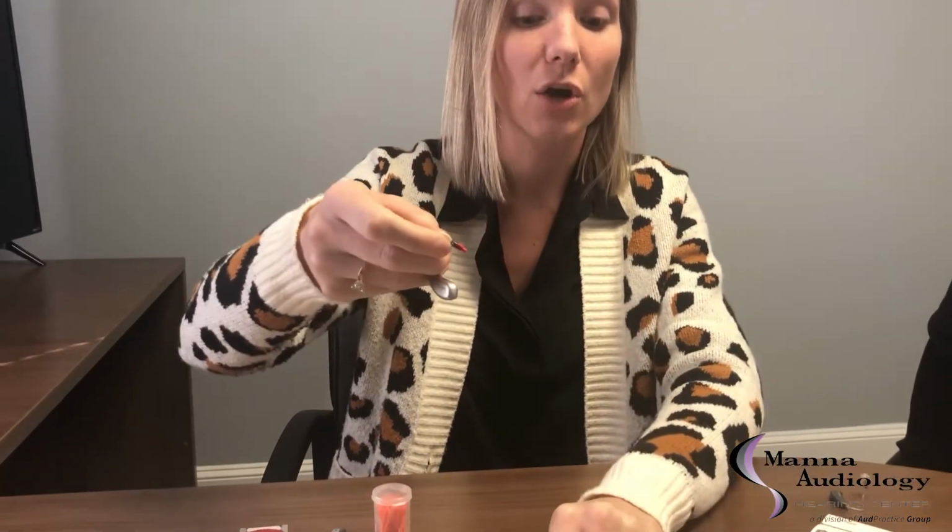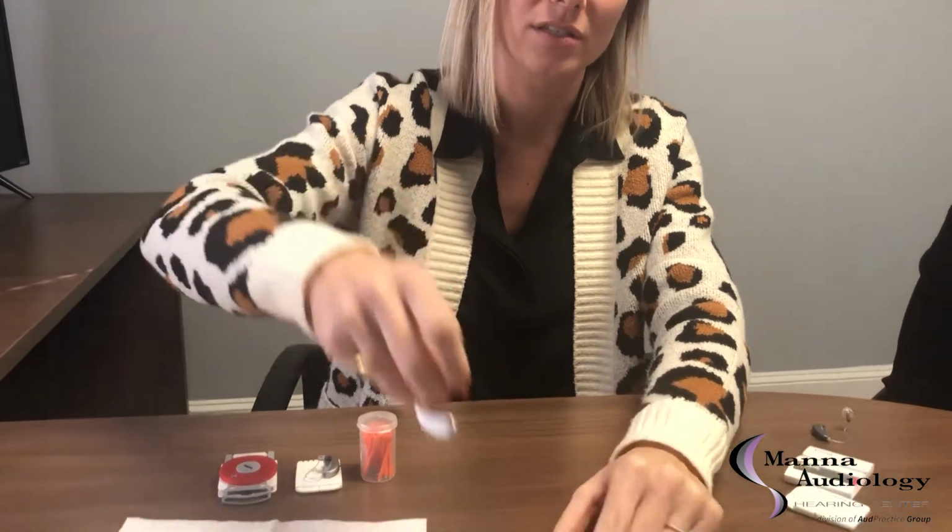The disc has pictures and numbers. So the number 1 is the trash can. That's where you're going to get rid of the old wax trap. And then the number 2 is going to be the new wax trap. So what you're going to do, once you take that rubber dome off, you're going to take the end of the speaker here, and it's going to go in the number 1 slot first.